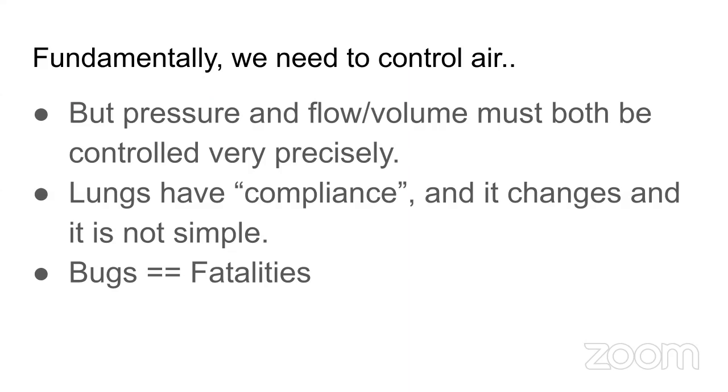If you blow too much air into the lungs, or you blow too hard, or you blow too quickly, you damage the lungs. And these are people who are paralyzed and helpless when they're intubated. So any mistake can be a fatality. And a software bug in Arduino code here could lead to a fatality.